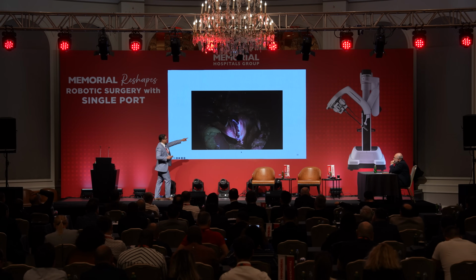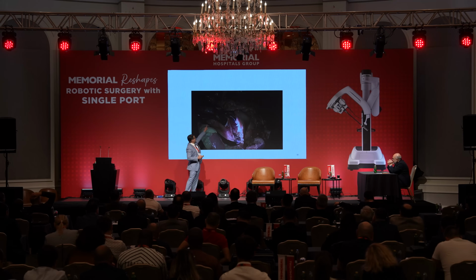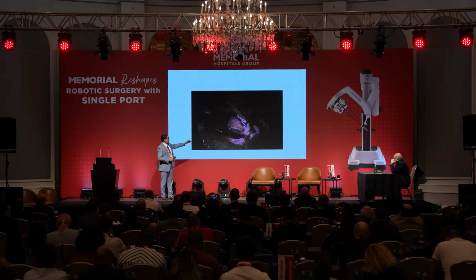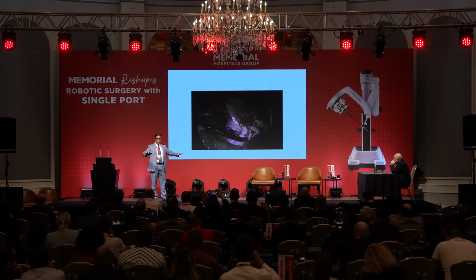So I did the ileocolic here. I lifted the ileocolic, and I'm making medial to lateral dissection. The camera now is in the cobra head, but I'm looking up at my ileocolic pedicle. And I don't take the vessel early. I like to create my tunnel underneath the right mesocolon. So right now, I don't have the visualization that I want to specifically get my tunnel established.